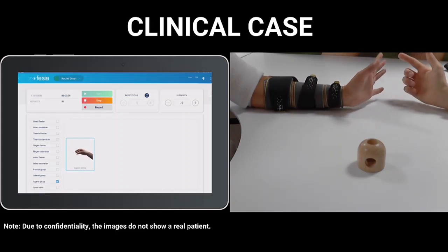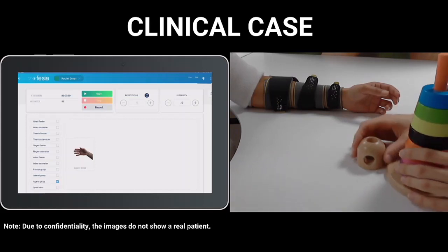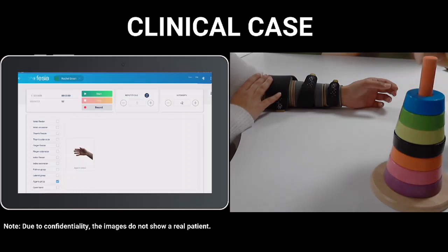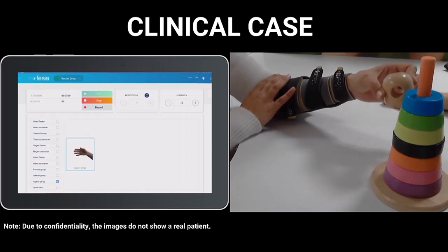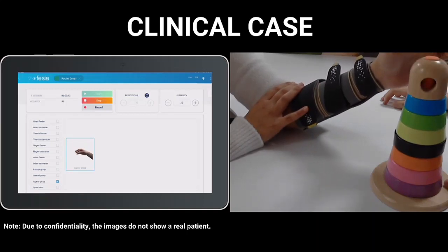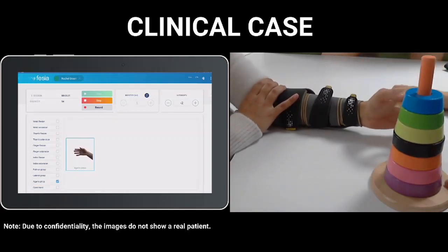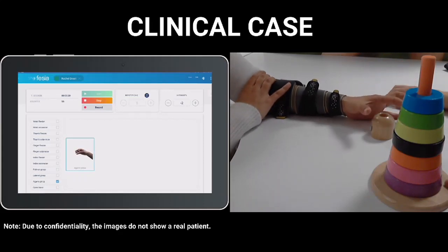Now, perfect. And once she's used to this configuration patterns and she knows more or less which are the times, I am going to ask her to pinch this object here and to introduce it here. And then in the next pattern, the same, but in the other direction. Okay, Rachel, I will start it now. Perfect. Introduce it and extension. And in the next cycle, do the same, but in the other direction. Perfect. Let's do the same. Perfect. Well.